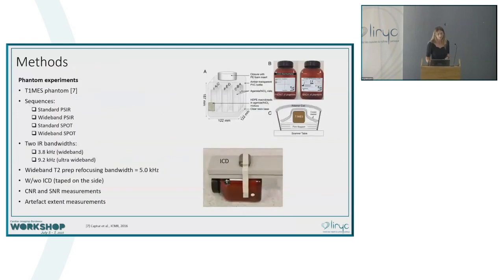I first applied this wideband SPOT technique in the phantom called TIMES. This is a phantom where you have 9 vial tubes representing the healthy and injured myocardium and also the blood. I applied the different sequences.